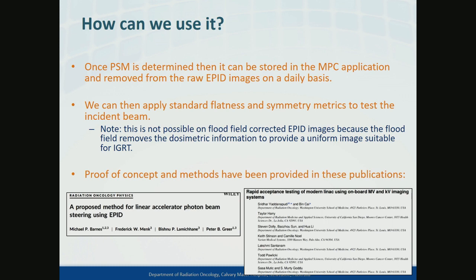And in the literature, some people have taken a look at this, and the two publications here provide some methodologies which I believe could be used in MPC in place of the uniformity check. And I'm now going to quickly discuss both of these publications.